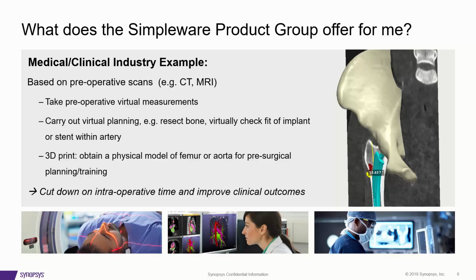So what that means is our process can be utilized to create structures that can then be used in the design of patient-specific instruments, for instance, cutting guides and the like, but also 3D anatomical models, which is more the focus of this webinar today, for surgical planning and for the education of patients for the operations they will be undergoing, and also the training of medical students within the educational arena.